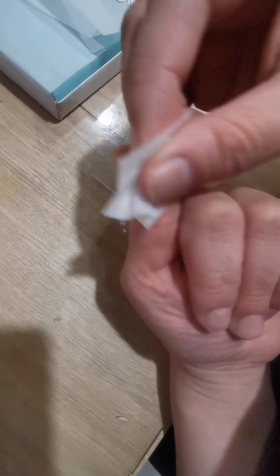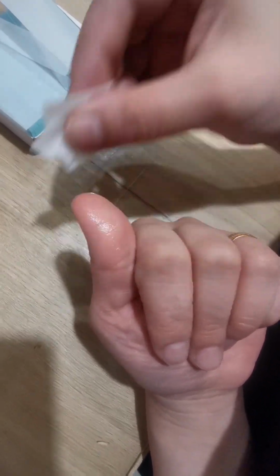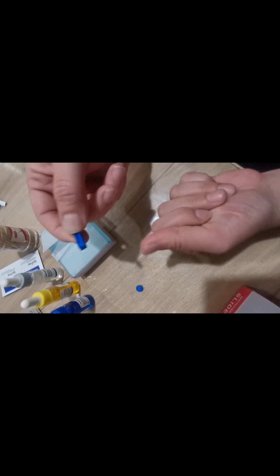And we also need the slides to do the test on. First of all, you need to clean the area to be sure that there is no pathogen, bacteria or microbe on it. You'll take the lancet and open it like this, but be sure that you don't touch it in order to remain clean. Then you will prick the finger. Then you will take the drop of blood.